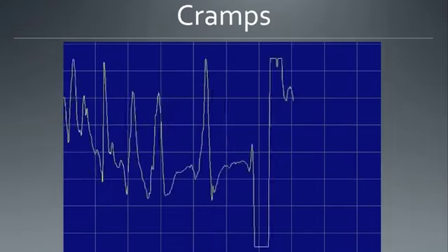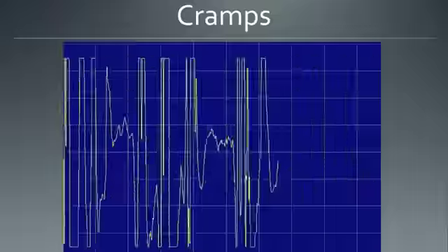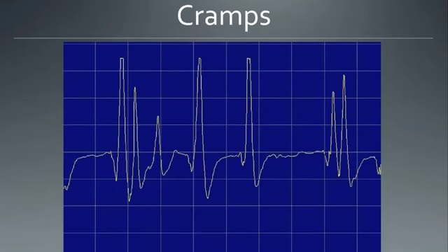The muscle is completely still here, and you see activity filling the screen, and the patient is not moving. This is a cramp. It's very painful. Stop what you're doing, stretch the muscle, wait a few minutes, and then proceed.